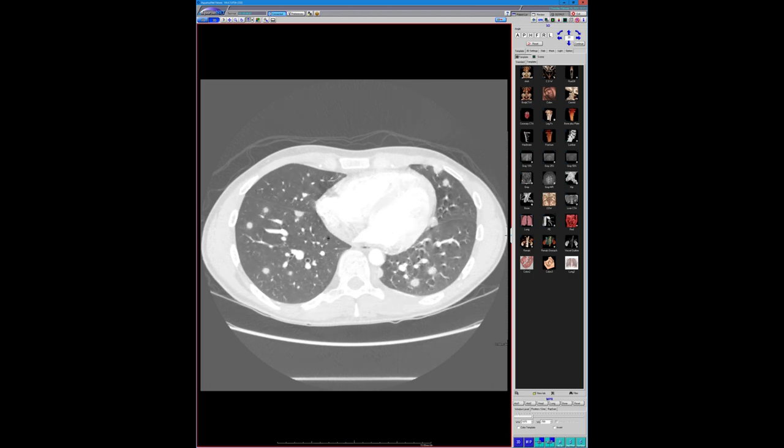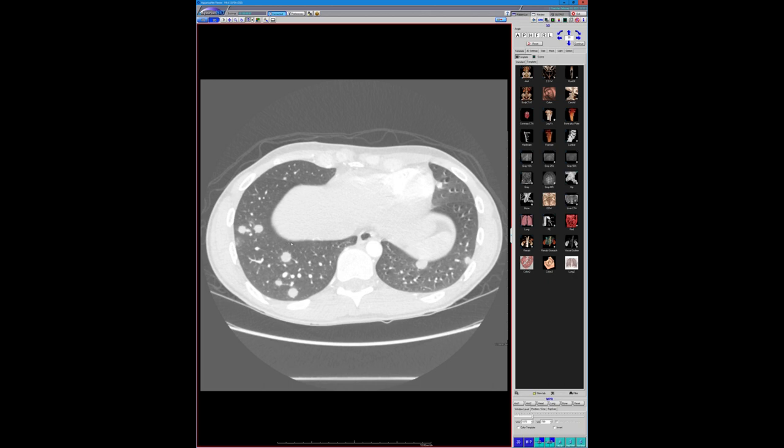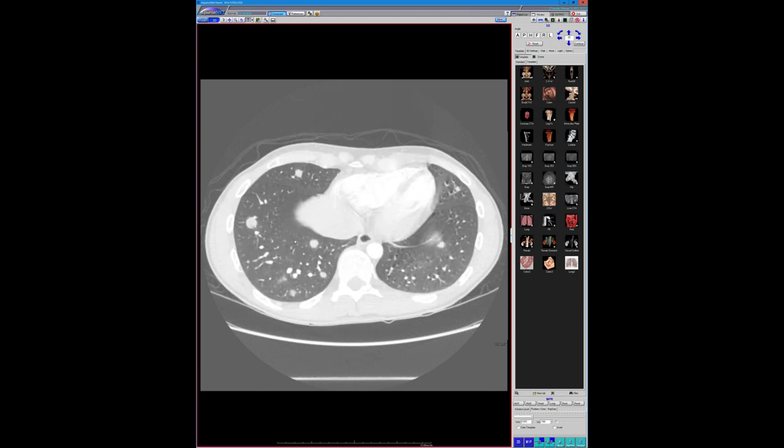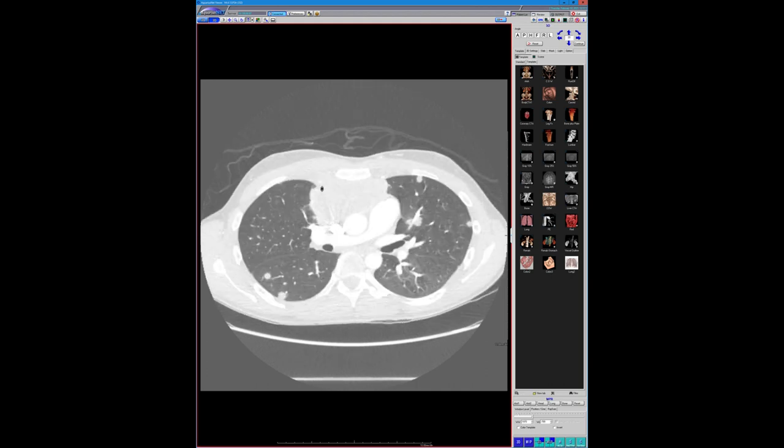I still thought germ cell tumor was going to be just as likely. But this turned out to be actually a non-Hodgkin's lymphoma — here's an air bronchogram. He's like 20 years old. We often think of non-Hodgkin's as affecting older patients. Hodgkin's has a bimodal age distribution occurring in younger patients but also very old patients. This is a young age for non-Hodgkin's, but it was just a subtle finding on a portable radiograph.